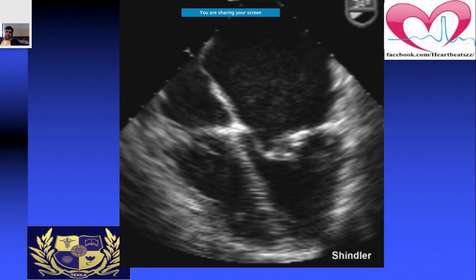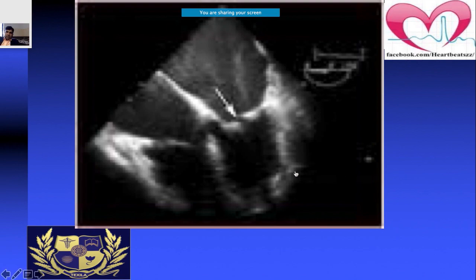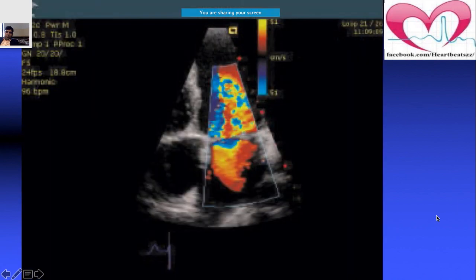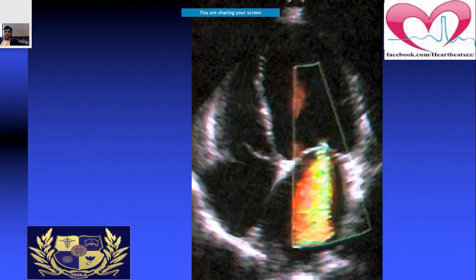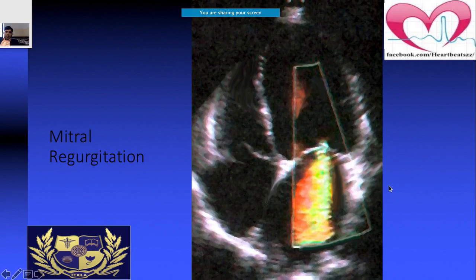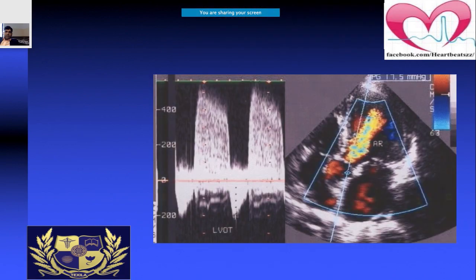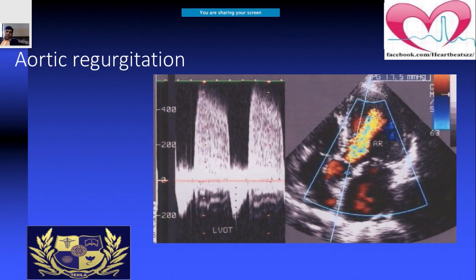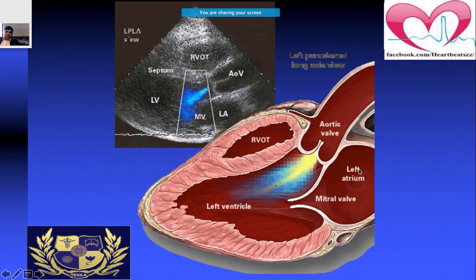In the four-chamber view, if you notice something unusual and add color Doppler, you may see a large jet indicating mitral regurgitation. Similarly, in the left ventricular outflow tract across the aortic valve, color Doppler reveals an aortic regurgitation jet, which can be visualized in the left parasternal long axis view.